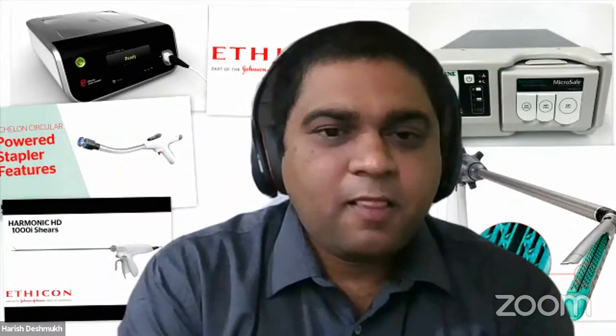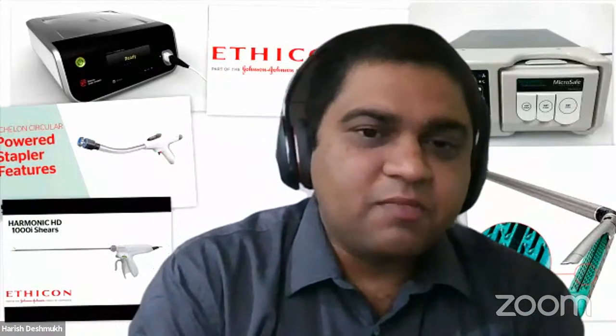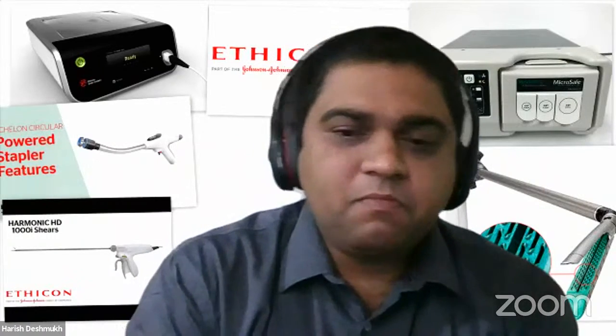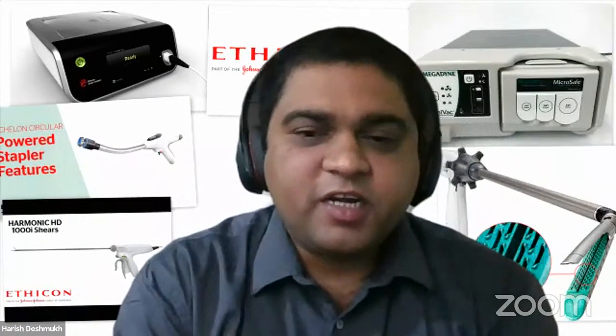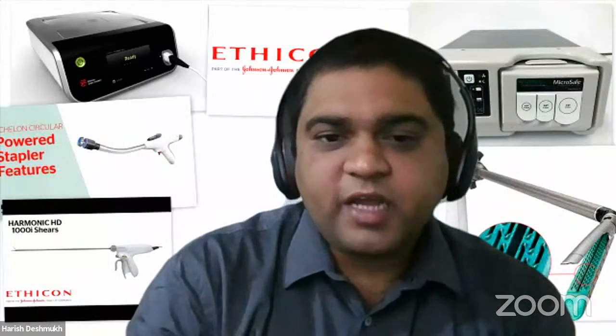Yeah, in gastrojejunostomy, sir, linear different types of staplers with side-to-side anastomosis. We have different linear cutters available in the market, which give you varied tissue thickness. When you're doing a gastrojejunostomy, it is very important to understand the tissue thickness we are getting from the stomach end.